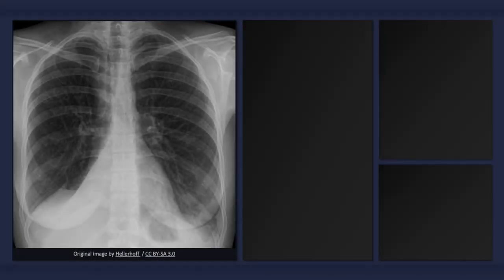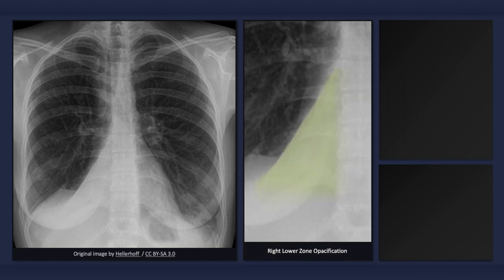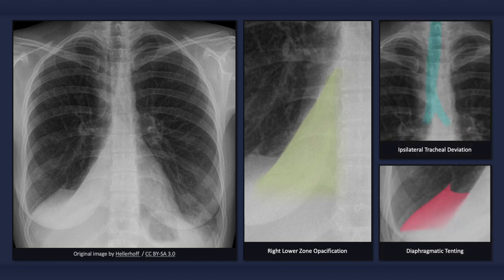To quickly recap, on an X-ray depicting right lower lobe atelectasis we might expect to see right lower zone opacification with effacement of the borders between the lung and both the heart and the medial aspect of the right hemidiaphragm, and signs of decreased lung volume such as ipsilateral tracheal deviation and diaphragmatic tenting.